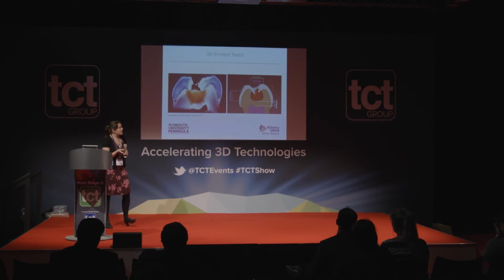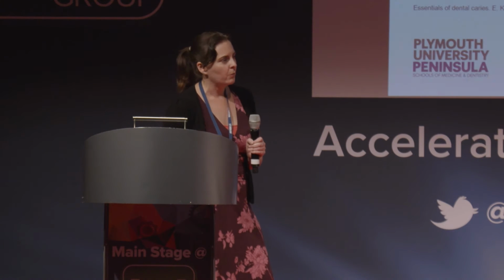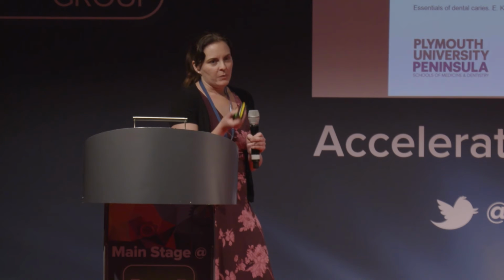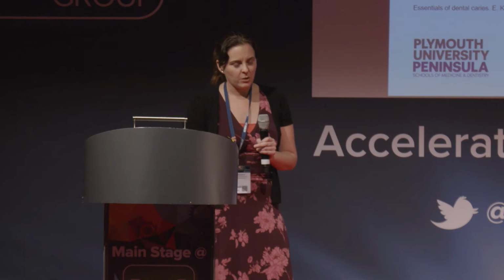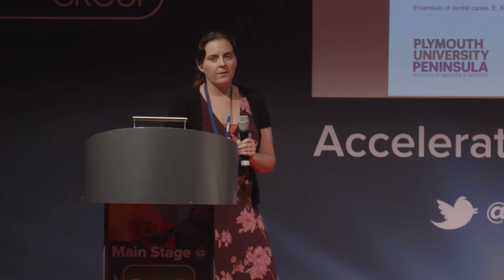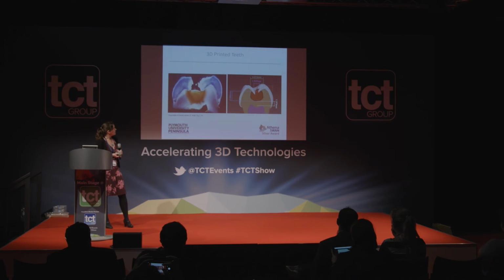So this is what we came up with, and we designed this using CAD, but there's lots of different ways you could get a model of a tooth with internal structures. The previous speaker was talking about cone beam CT as one of them, but we chose to use CAD because we wanted to add some details, and we were very specific about what we wanted in terms of the size and extent of the decay.